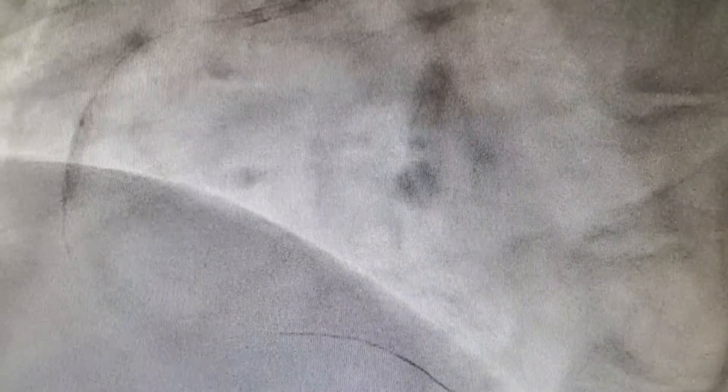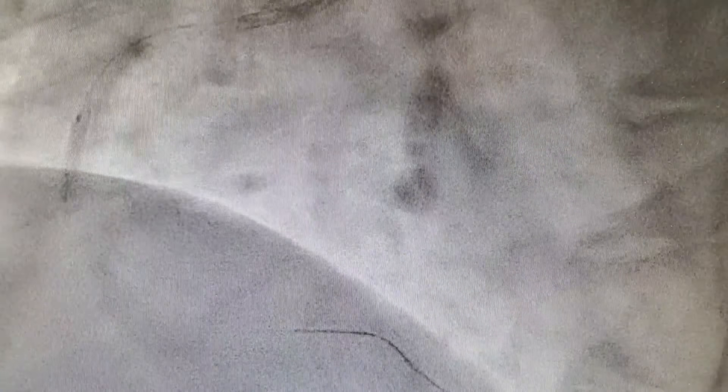Over this wire, a small balloon is then passed and dilates the blockage. This is how it looks when I am performing this procedure.